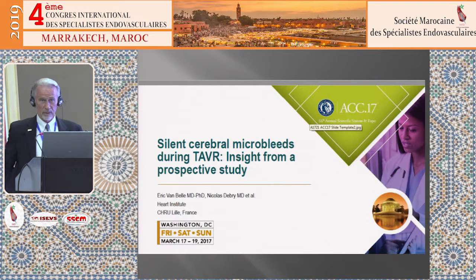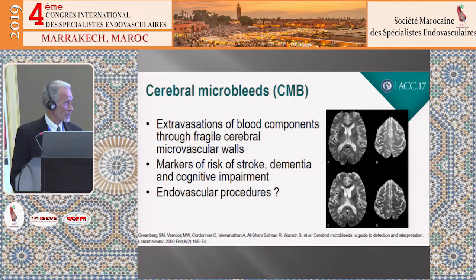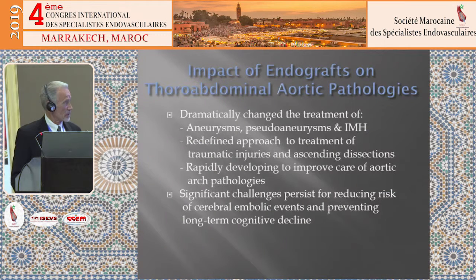One of the other things that's important in this area is to look at embolization related to this. We've all seen this with the TAVI valve cases. This is from data, some from the ACC, where they're actually now calling these lesions microbleeds that have long-term implications. And I know Dr. Lumsden will talk to you later about some ways to characterize these, but treating these embolizations and cutting down the events in the procedure is going to be particularly important.